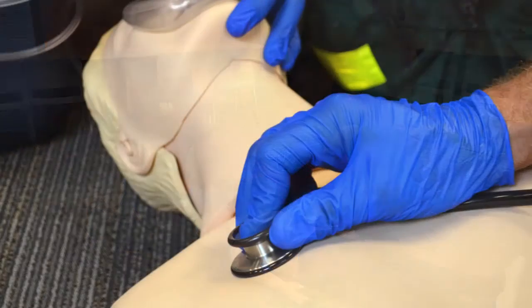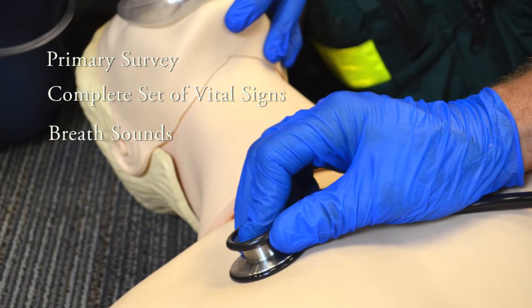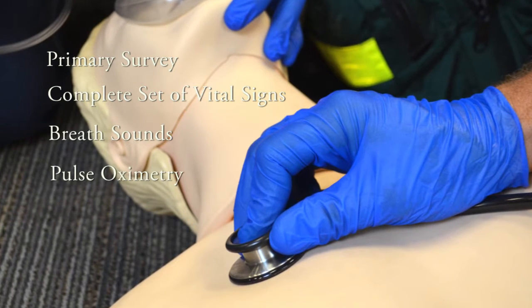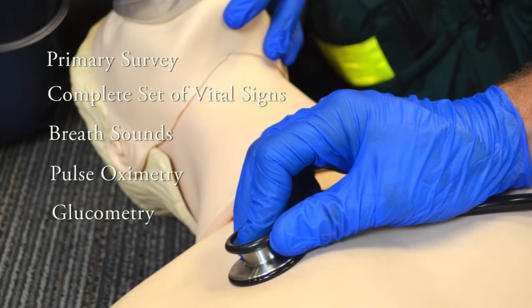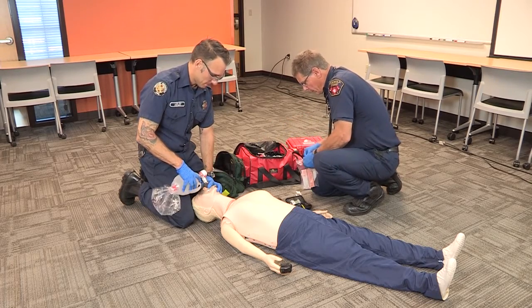Once you've completed the primary survey, obtained a complete set of vital signs, listened to breath sounds, checked pulse oximetry, glucometry, and the patient's pupils, the next step would be to assemble and administer Narcan.